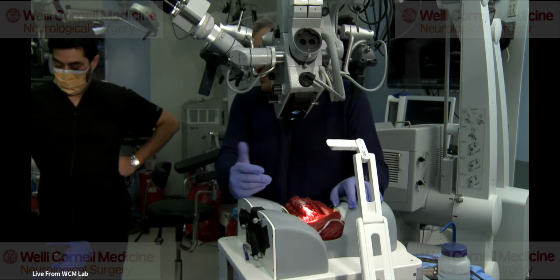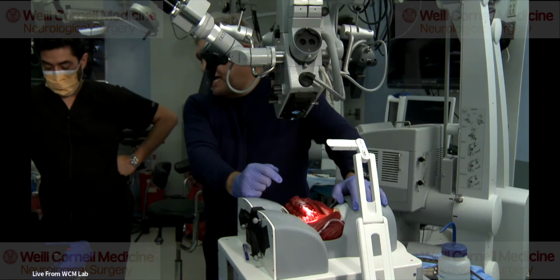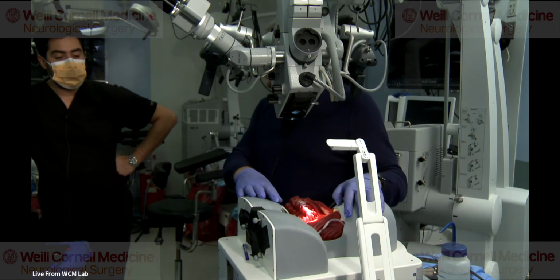So the scan now takes a few minutes. I mean, here we can't get a scan, but in a real case, you drape the patient, everybody leaves the room, you get a spin, and it takes a few minutes.